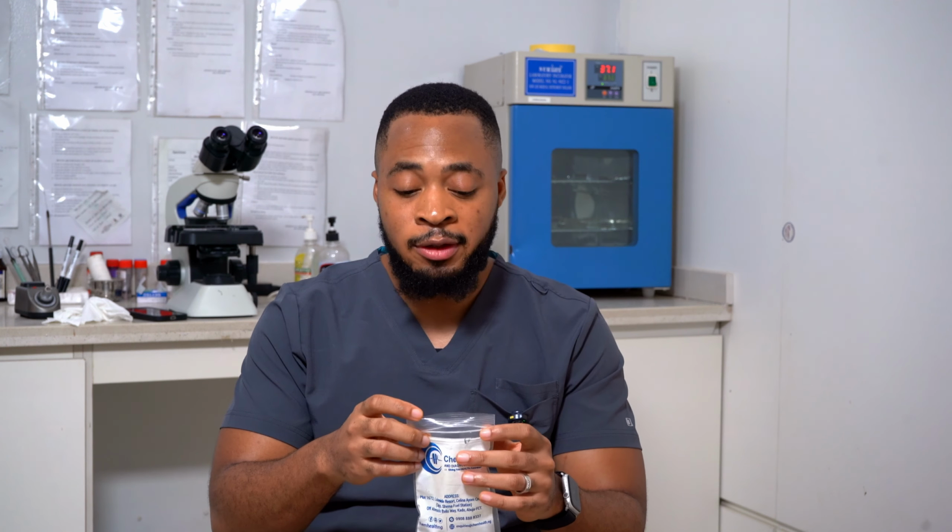So the stool sample is meant to be collected on a clean toilet roll when you're in the toilet. And you're meant to use this spoon to scoop the stool, just like the size of a grape. Please, for this sample, you are not to fill up the container. This is a sample that we do not want you to be generous with at all. So once you've collected your stool sample, you're now meant to seal the container to avoid any contamination. So once you've sealed the container, you put it in the Ziploc bag we provide for you and seal. Very simple. So once you're done, you give this to the lab technician. The lab technician then takes it to the lab for us to do the dirty work.